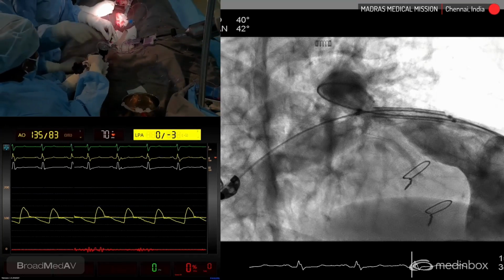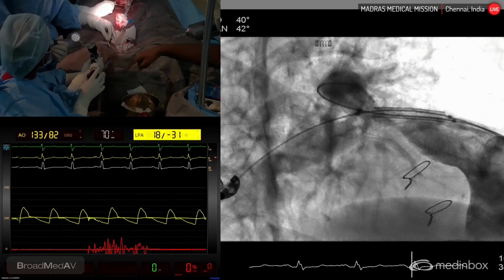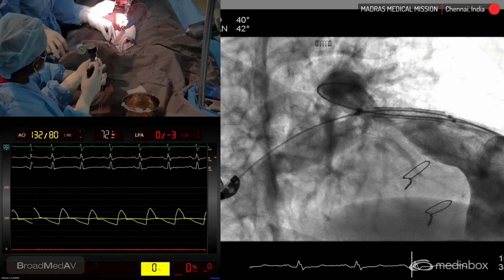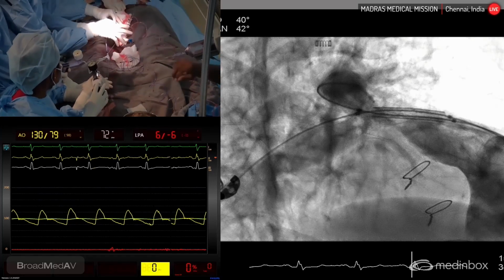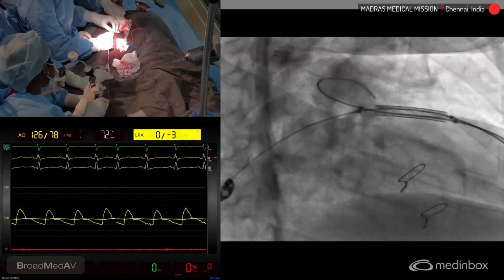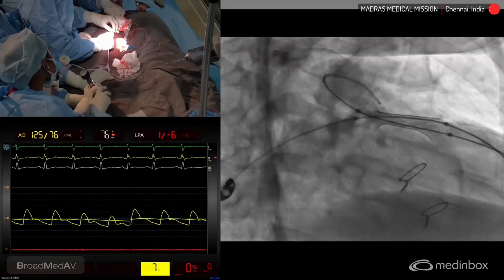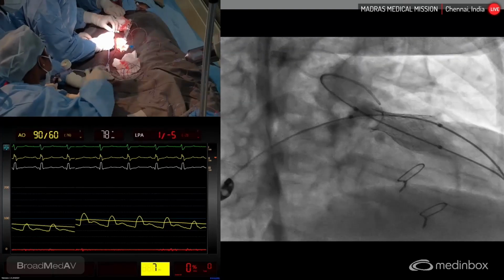Okay. You hold it. Now you have to go up and, okay, you are controlling the wire. Yes, sir. Sister, you take one indiflator. Both of you should inflate together progressively. Keep inflating. 3, 4, 5. Keep inflating. What is the burst pressure?